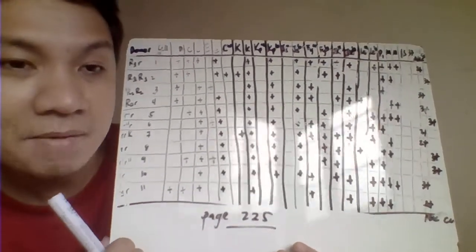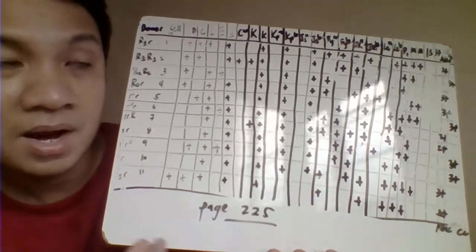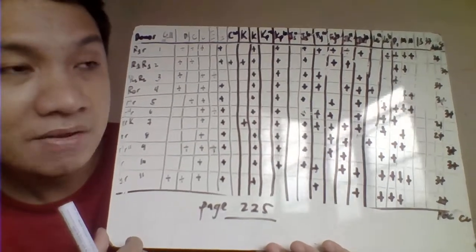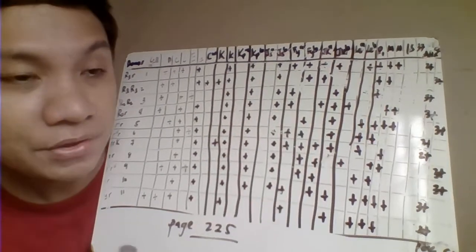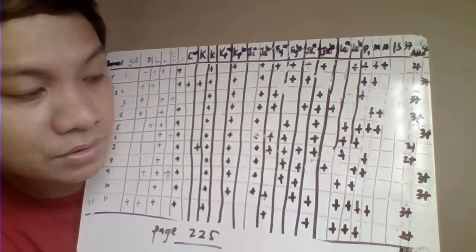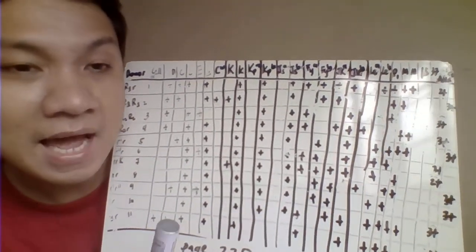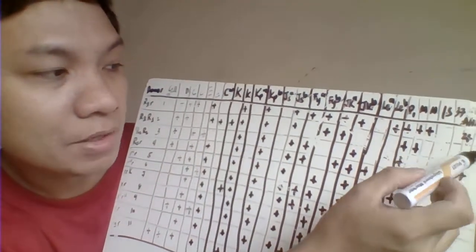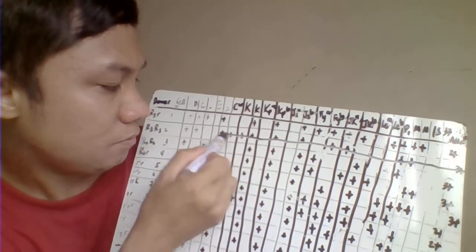This means that the antibody we are suspecting in our patient plasma or serum is reacting at the anti-human globulin phase. So already here, all the negative panel cells, that is not it, you need to cross out. Since our panel cell number 2 is negative, it is not this one, it is ruled out.